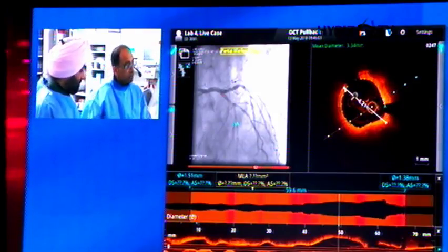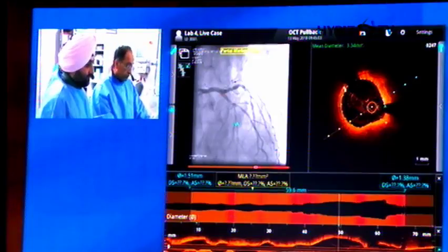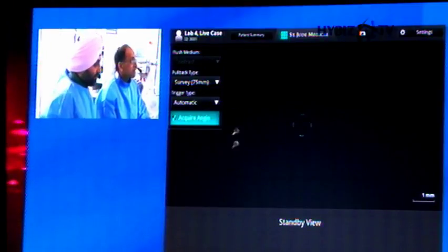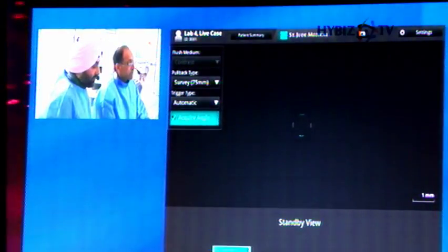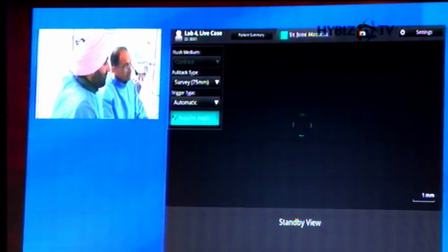So if you could show the last post-deployment film. Actually, we haven't done one, so that's exactly the point. To save on contrast, we've deployed the stent. We're just going to OCT now. So that's the OCT catheter. I've been through this already. It gets stuck at the junction point, just crossing through. It's important to get the lumen downstream, the distal reference point down there. And that's now just beyond the stent, I think.